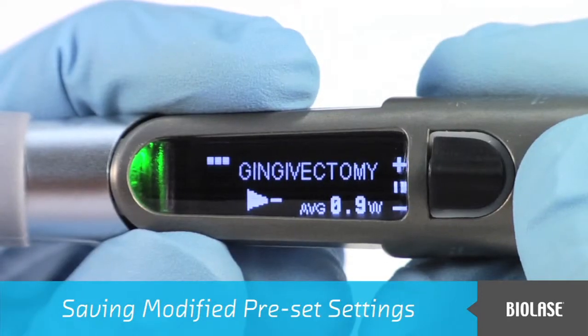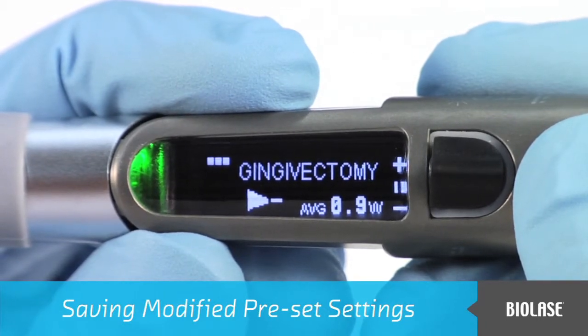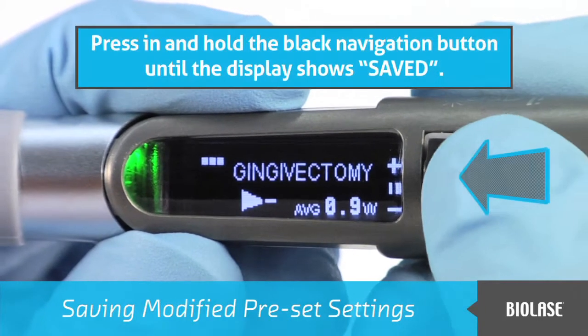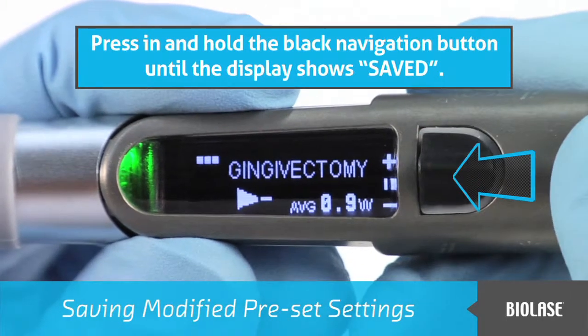If you have changed the power or pulse mode of a preset and would like to save the values, first make sure you are in Ready mode, as indicated by the green LED. Then press in and hold the black navigation button until the display shows Saved.